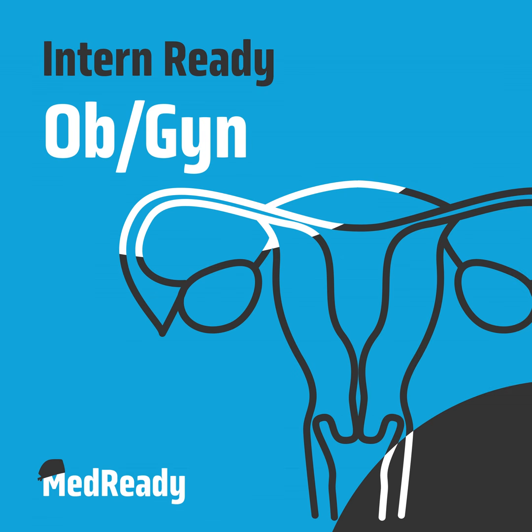Great. And so when you are preparing for your first case, what is on your pre-op checklist? What are you doing for chart review? Yeah, definitely. So the things that I look up beforehand are, one, why is this patient even getting the hysteroscopy? So I look at previous clinic visits and try to understand what their indication is. The other thing I always make sure to check is whatever imaging they've had done. So whether that's a transvaginal ultrasound or an MRI, I'm specifically looking for two things.